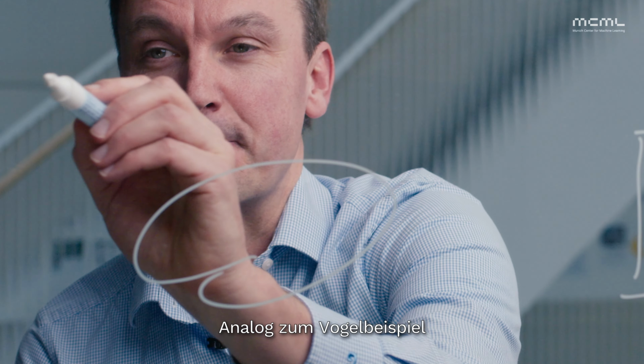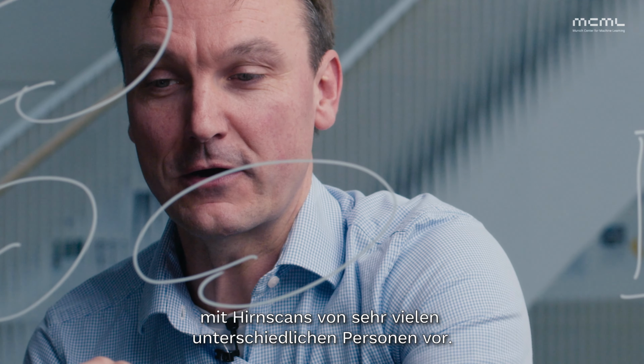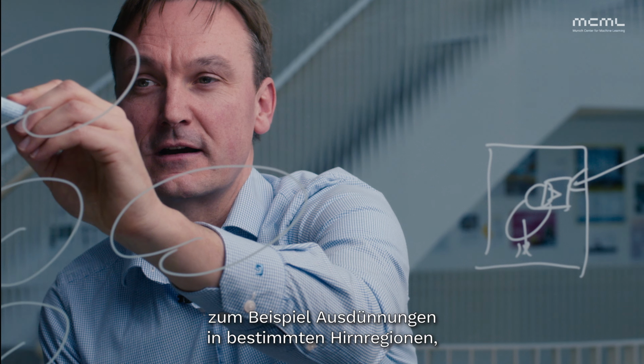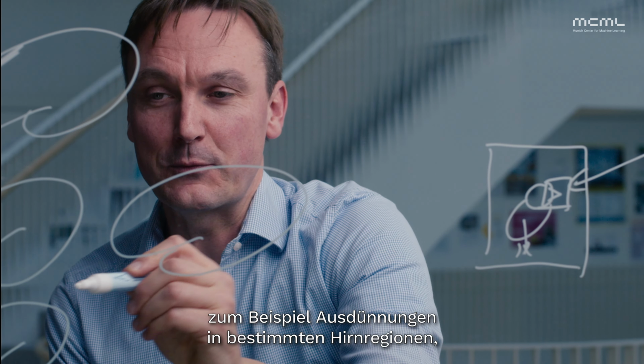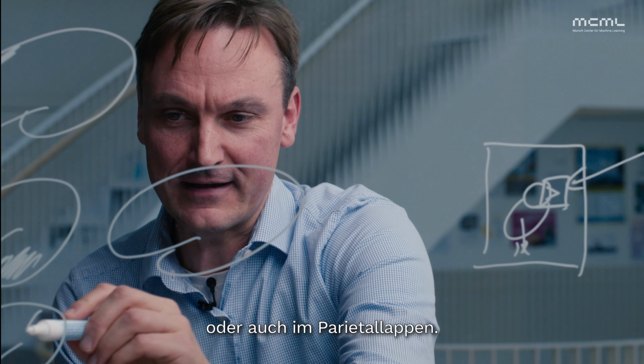Similarly to the bird example, we now have here a training set of different brains from a large collection of subjects. And again, the algorithm here learns maybe specific patterns. For instance, here there may be thinning in this region in the brain, or here, for instance, in the temporal lobe, or for instance, here in the parietal lobe.